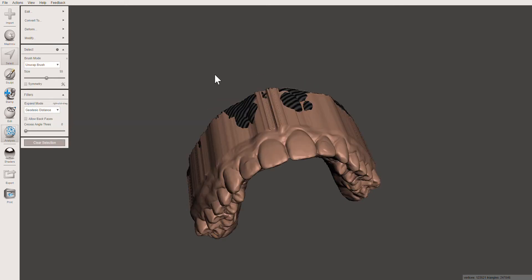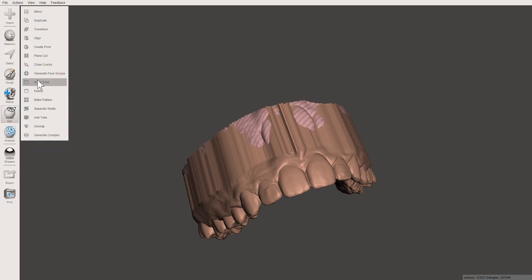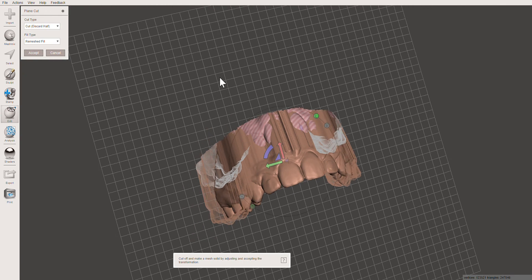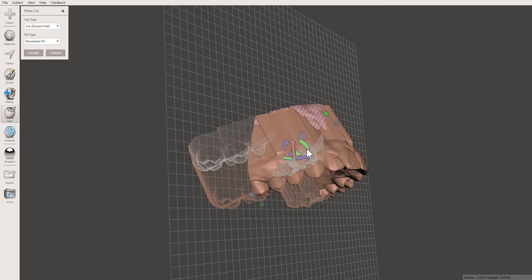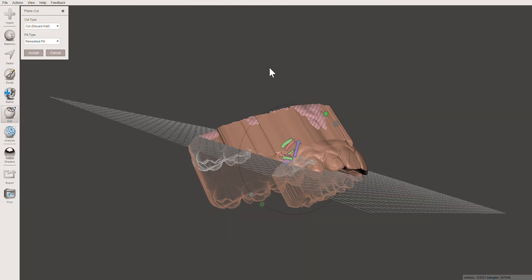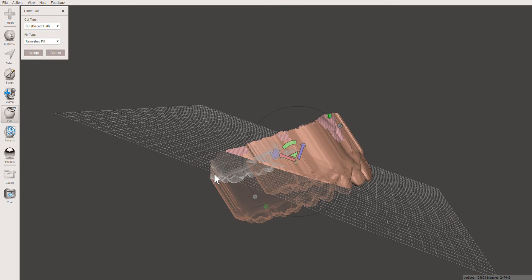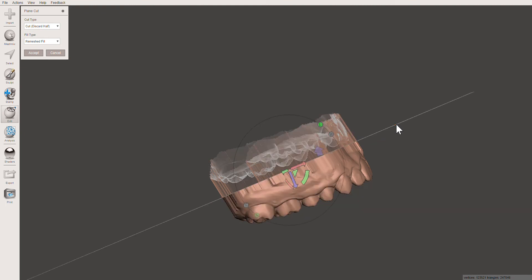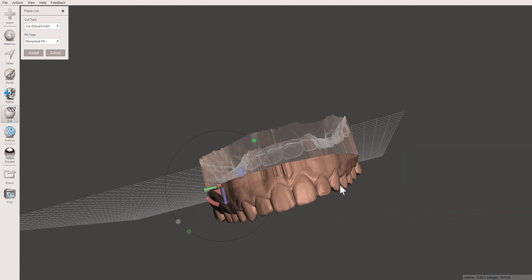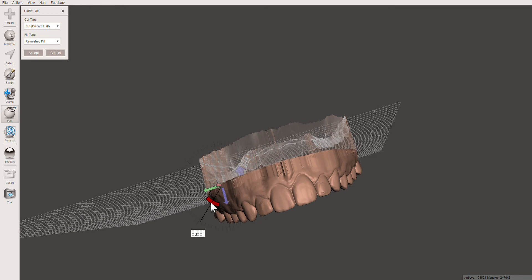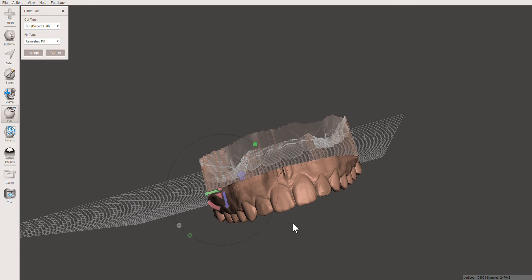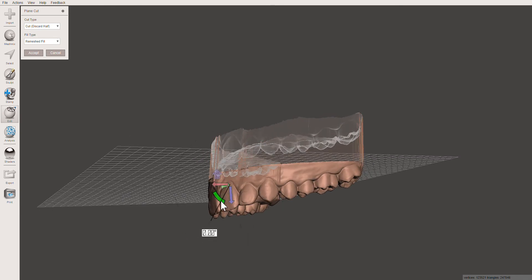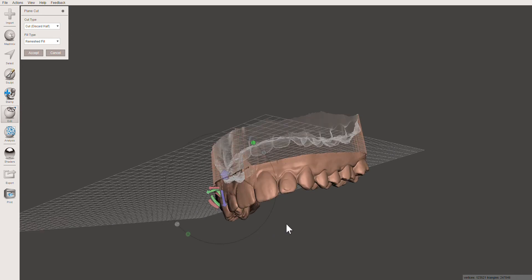Now we're going to create a flat base. Go into Edit and Plane Cut. A plane will show up and you can do one of two things: use the widgets to rotate the plane how you like it, or use your mouse to click and drag to position it quickly. Then adjust your plane using the widgets to move up and down or rotate side to side. You can create as thick or as thin a base as you like — just rotate it in all directions to make sure you're getting the nice shape you want.